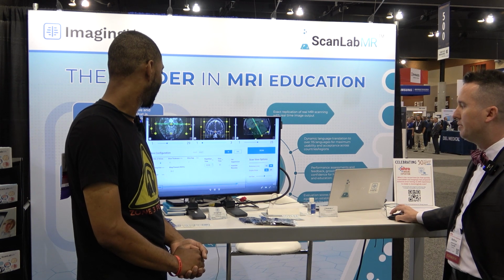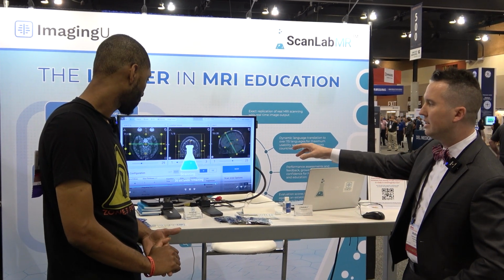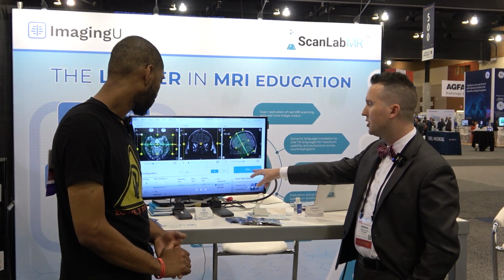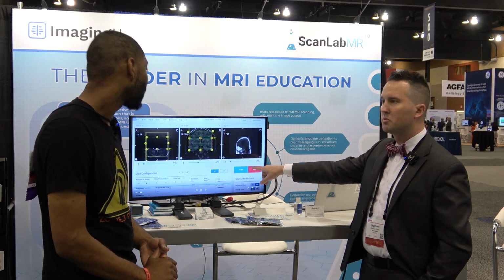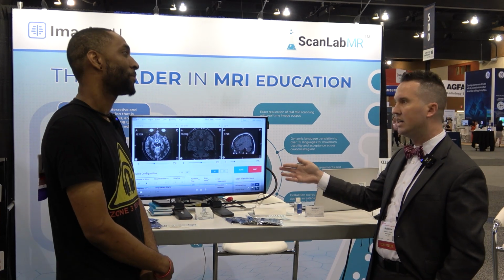Same thing. Something else we've added here: let's say you do something proprietary that nobody else does and that we haven't covered in ScanLab. You'll see at the end of these exams, after this comes out, it switch and it has an optional scan here, I believe, in a second. If there's something proprietary that only you guys do, you could instruct them on what you want to scan, what TR, what TE range, that kind of thing.